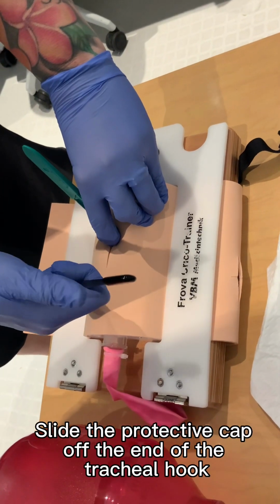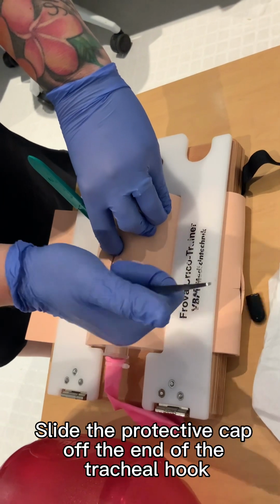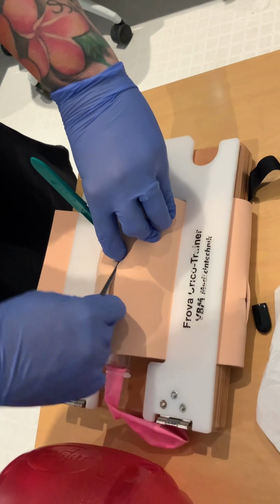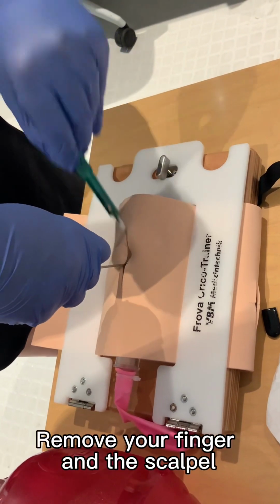Remove the protective cap from the tracheal hook. Insert the hook into the side of the trachea. Rotate it down towards the feet and up to the sky. You may now remove the scalpel.